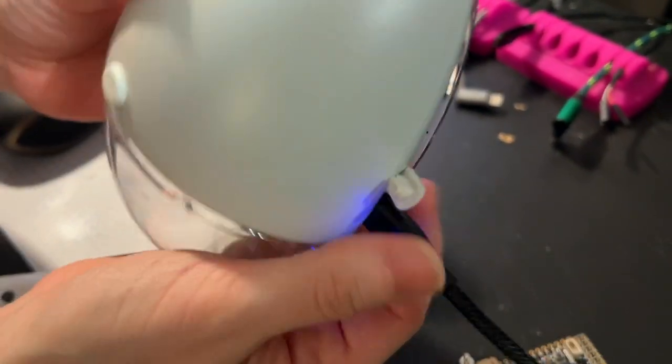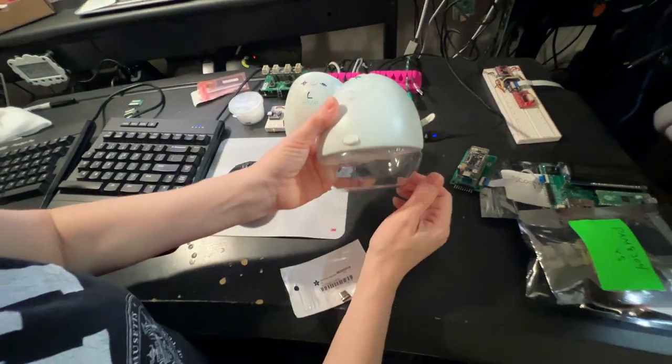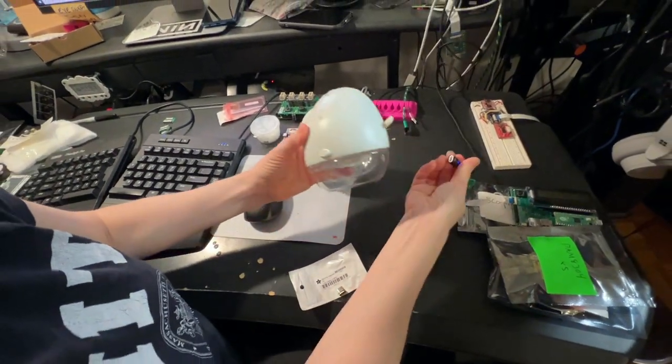When it's time to charge I just flip it on like that and it immediately starts charging. I don't have to worry about trying to line up the micro USB with the port at 4 in the morning — kind of tough, but this is much more convenient. Bam!